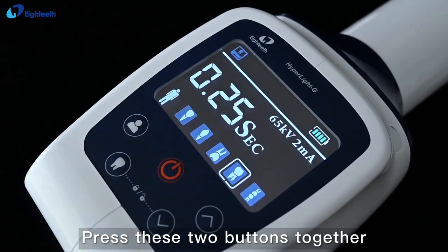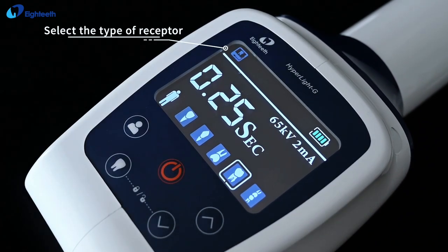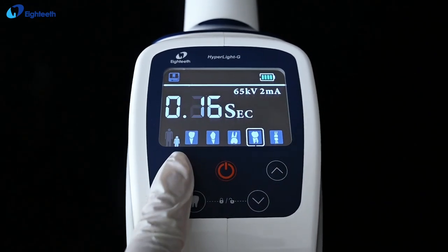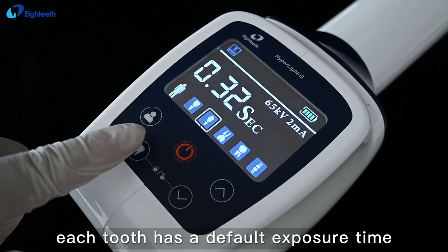Press these two buttons together to select the type of receptor. Select child or adult. Then select the tooth type — each tooth has a default exposure time.